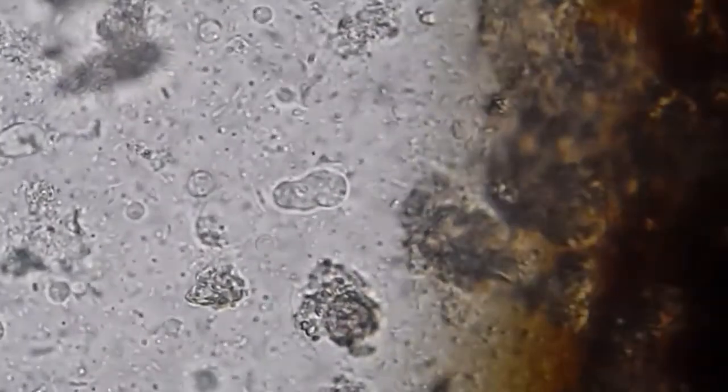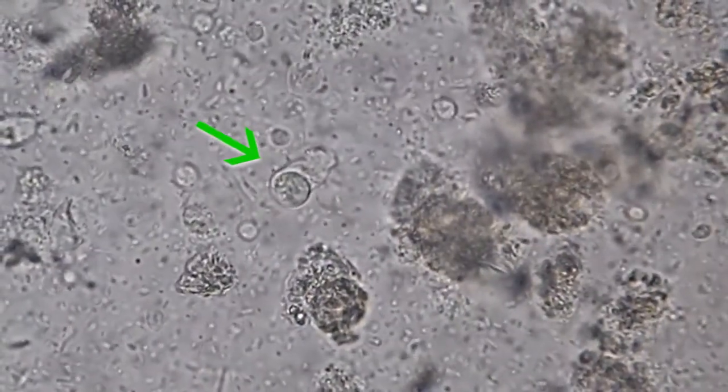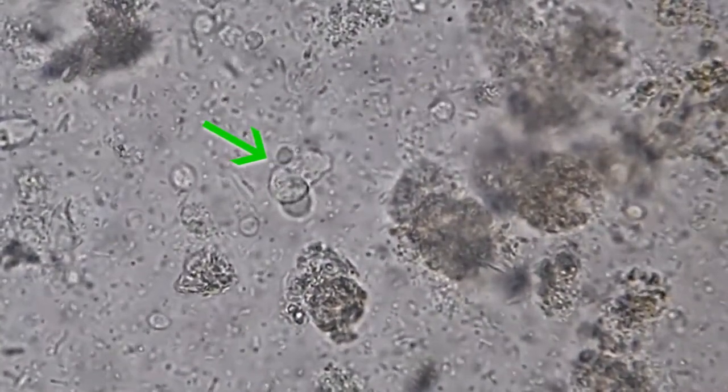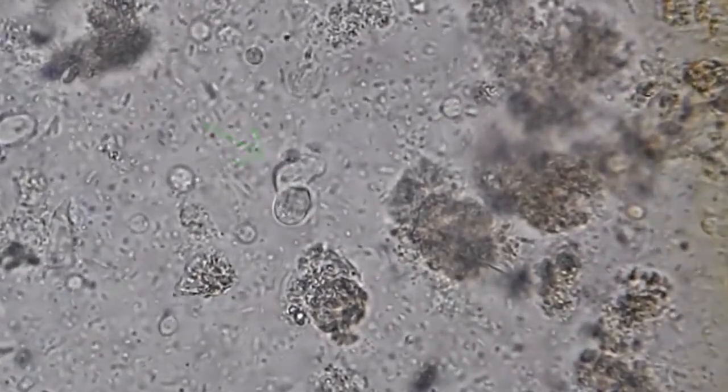Now, if you don't have access to stained preps or PCR or anything a little bit better, that can be used and can be very helpful in the diagnosis of species, because the other entamoebas don't have such directional movement and they do not move as quickly. So when you're talking about Entamoeba coli, hartmanni, polecki, they tend to be much slower moving, and they tend to also not have a particular direction of movement. Whereas here you're seeing Entamoeba histolytica moving with a distinct direction, and quite quickly.